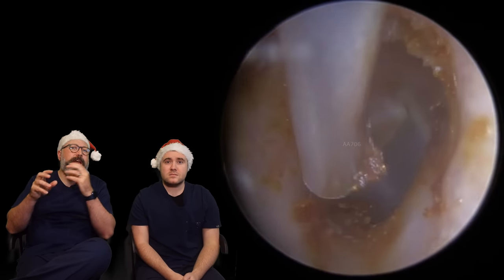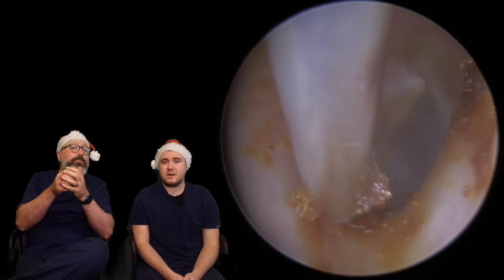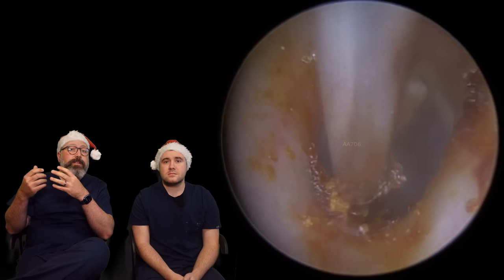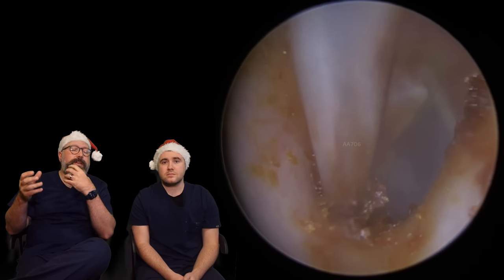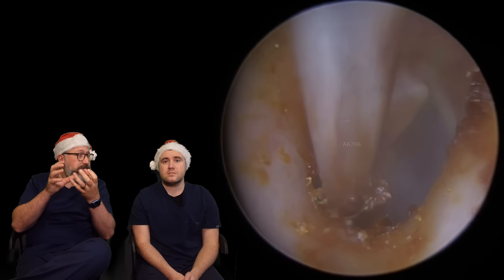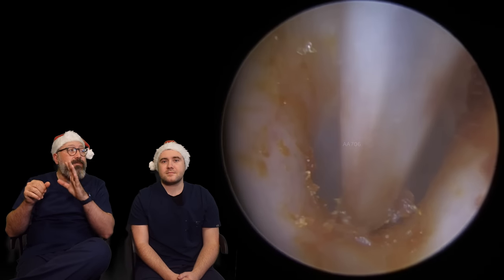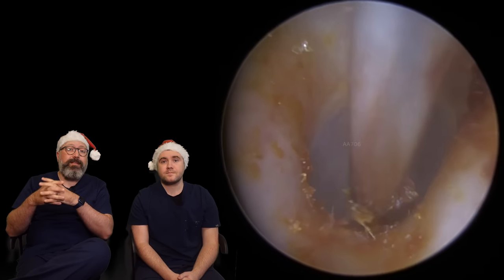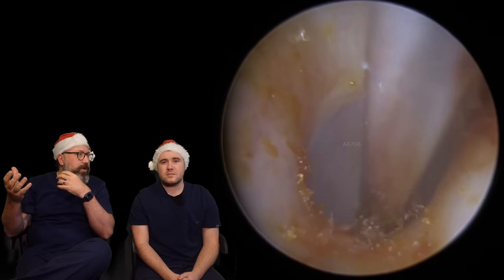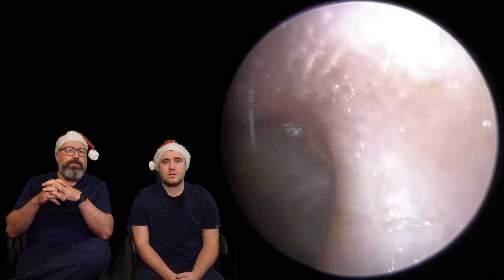There was a notable difference after this plug had been removed. It's not unusual — if you get even just a tiny little gap in that wax somewhere, sound can still get through. So it's not unusual for patients to have only one side as a complaint. When you take a look, there's actually wax in both, and you'll sometimes have quite a large, substantial piece of wax in there. But as long as that little gap is maintained all the way down, the patient wouldn't even know. Unless it was intermittently blocking with baths and showers, or if they lay on it — that would be the only time they'd notice any issues.